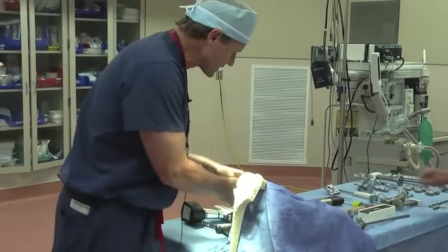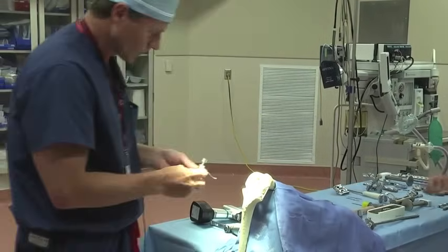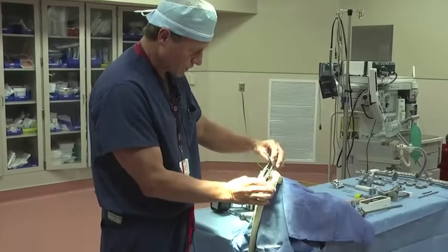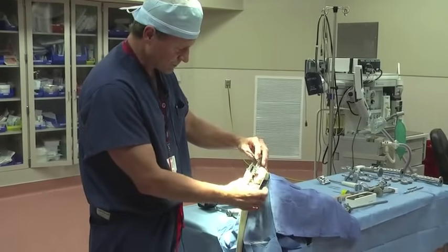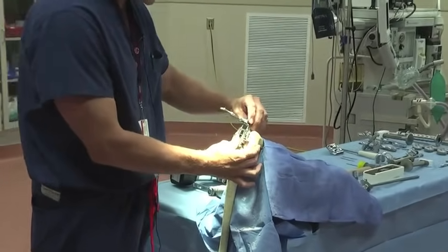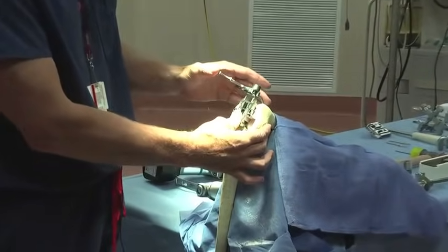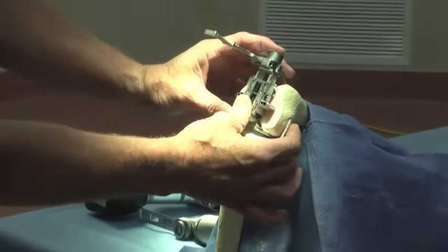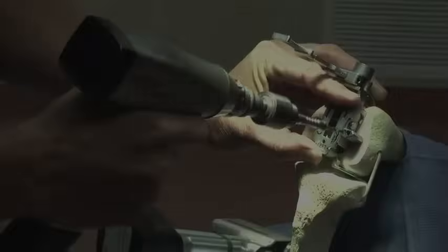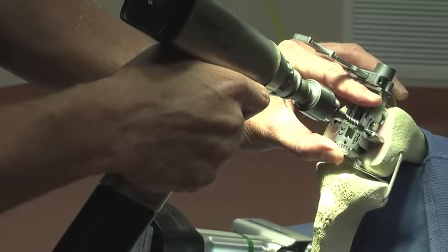We're going to use a sizing guide to figure out what size femur we want to use. We put these feet down up against underneath the bone right here, place the block up on top, and use a little stylus on top of the bone to make our decision. We'll read the measurement off of this area right here, and then put little drill pins into this guide.